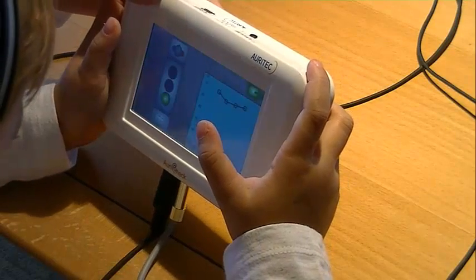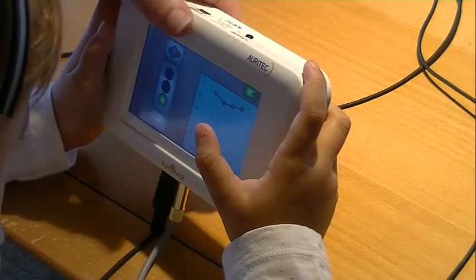Prima. Ready, fine. Perfekt. Gut zu sehen. Gut gemacht.